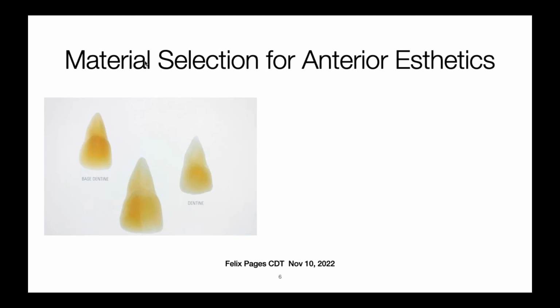So you would have enamel, you would grind it off and grind part of the dentine. All those crowns looked really high in value. And so basically the idea is to soften the light as it's coming in, going through different layers. And by the time it hits a substructure, whether it's a prep, a coping of some material, that it sort of gets scattered around and it's soft. So if you have a real quick bounce back of light, that's going to look like a high value in the mouth. And so you have to kind of control that reflection and transmission.